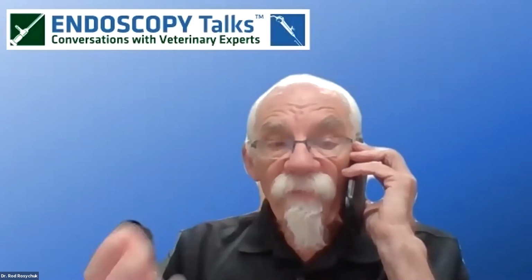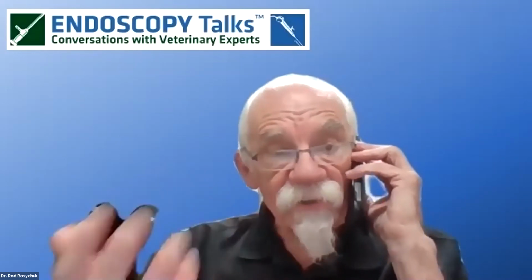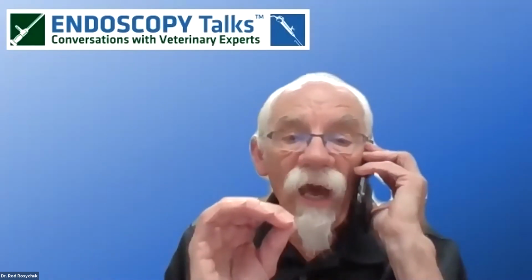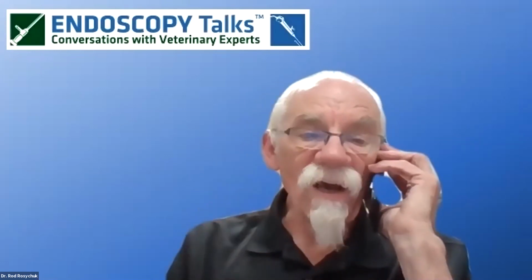Then, if I am flushing and I find that I am going to be in the middle ear because it is a perforated tympanum, the first thing I do is stop my flushing and again sample from the middle ear, cytology and culture.